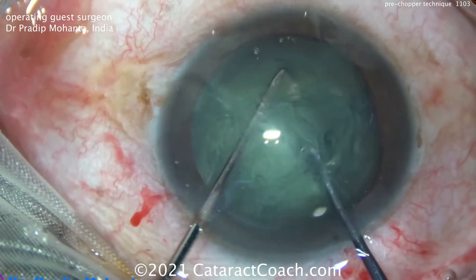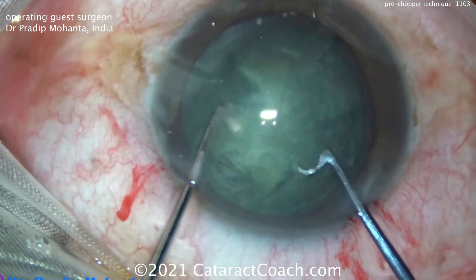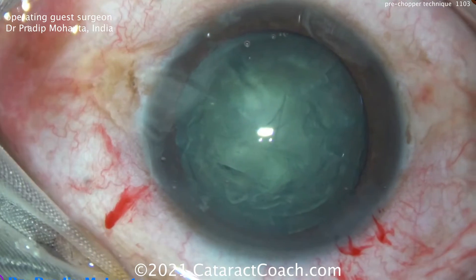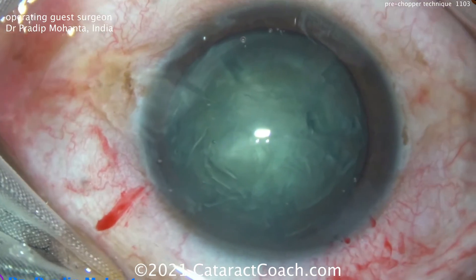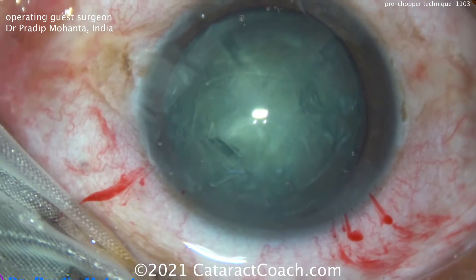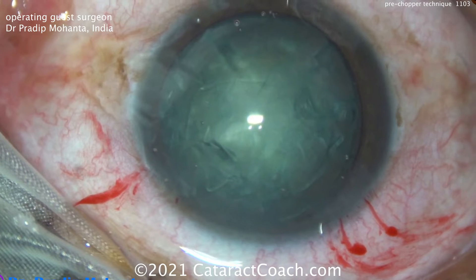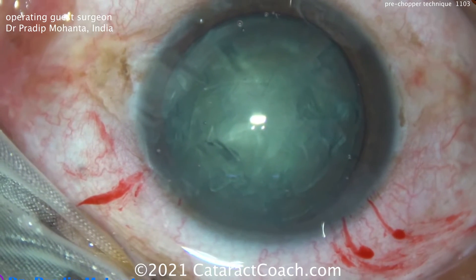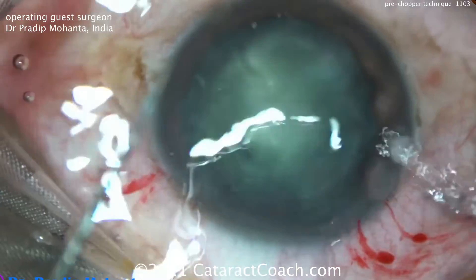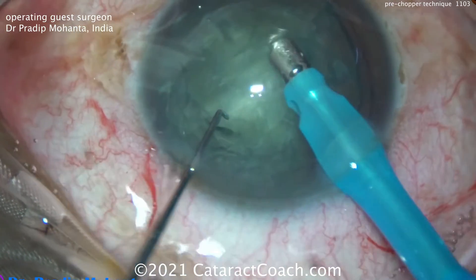Now the nucleus can be rotated — going back to normal speed — and it can be subdivided again. This is a nice instrument to mechanically break the cataract nucleus into smaller pieces. It works particularly well for this grade of nucleus, which is a moderate degree of nuclear sclerosis. No phaco energy is used. By doing it this way, you're able to split the nucleus very safely in the capsular bag. The key is the nucleus itself does not move — don't use the chopper to push the nucleus around. Instead, the chopper is used to divide the nucleus as the second instrument holds the eye still.